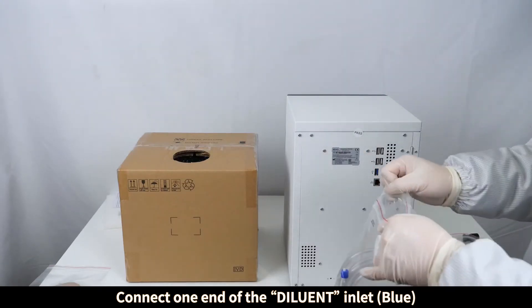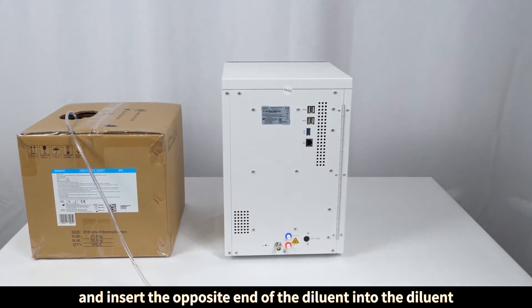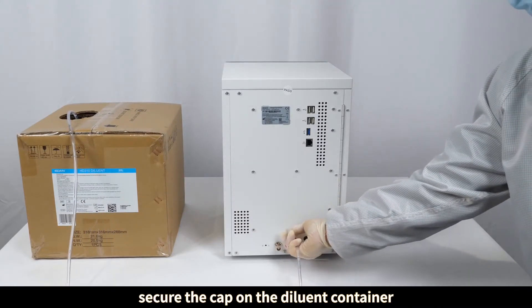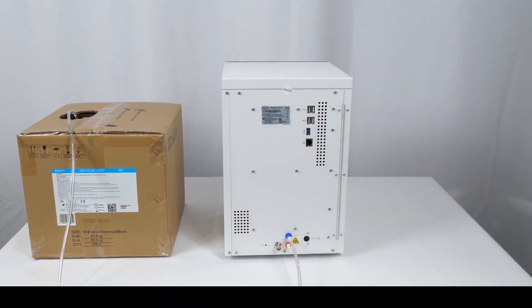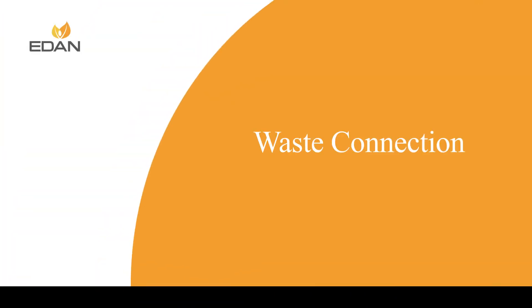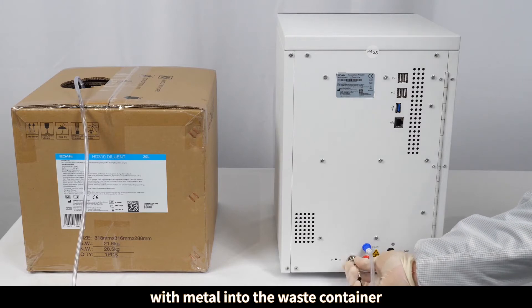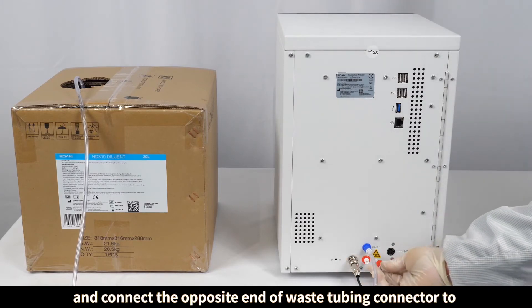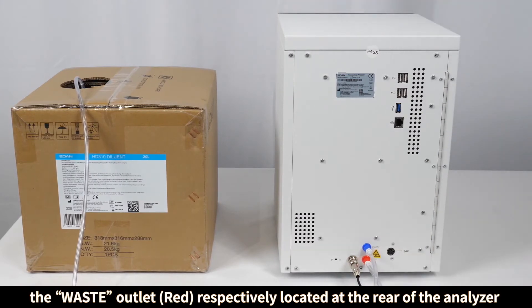Connect one end of the diluent tubing to the diluent inlet located at the rear of the analyzer, and insert the opposite end into the diluent container. Secure the cap on the diluent container. Insert one end of the waste tubing connector with the metal fitting into the waste container, and connect the opposite end of the waste tubing connector to the waste outlet located at the rear of the analyzer.